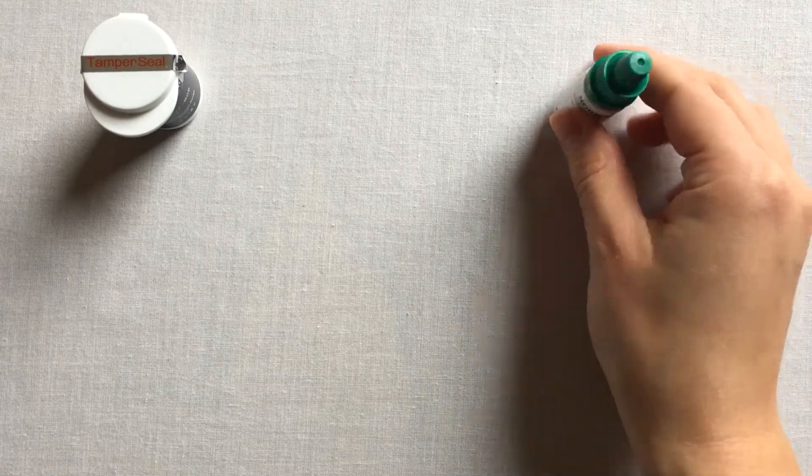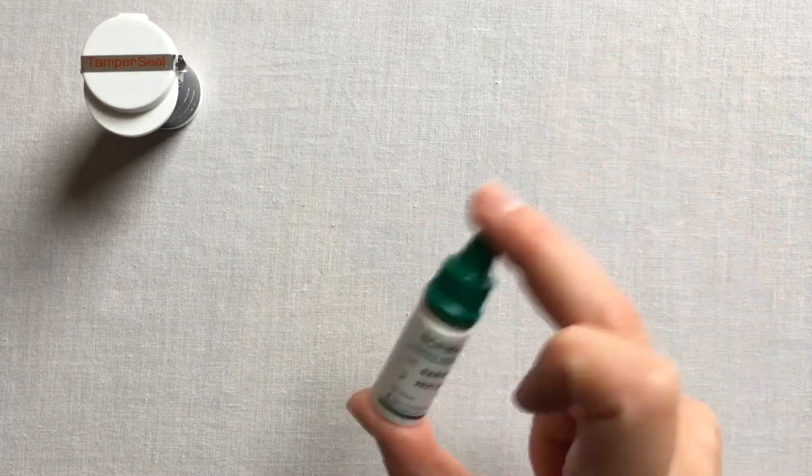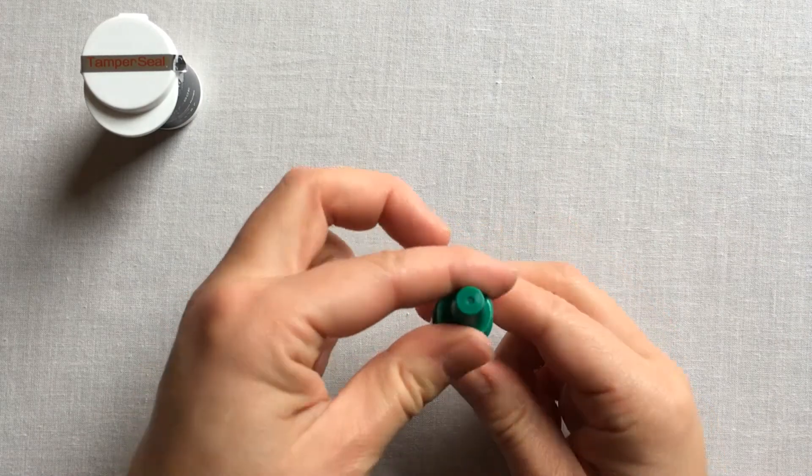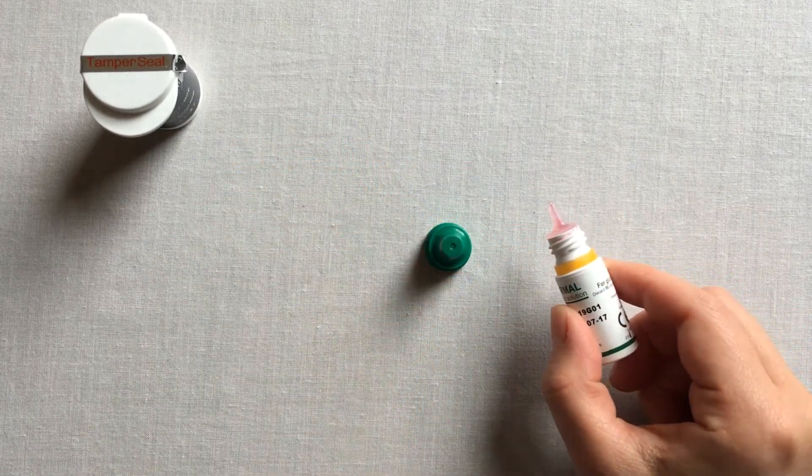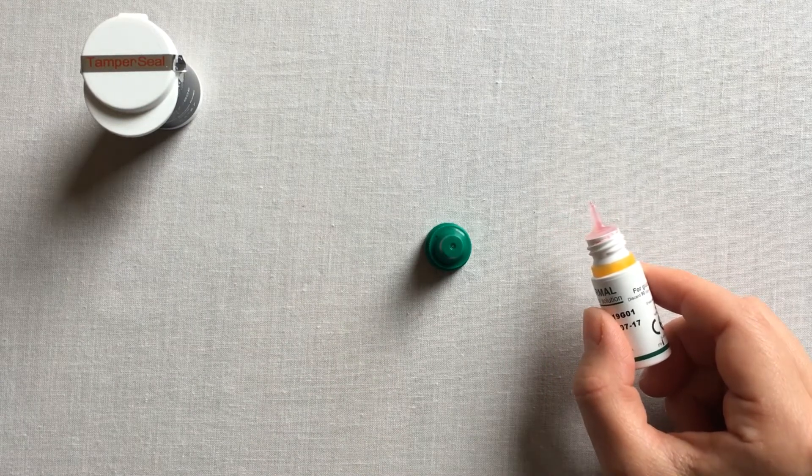Shake your control solution vial thoroughly before use. Remove the cap and place it on a hard surface. Remember your solution has a 90-day expiry once opened, so be sure to make note of the date you opened your vial.